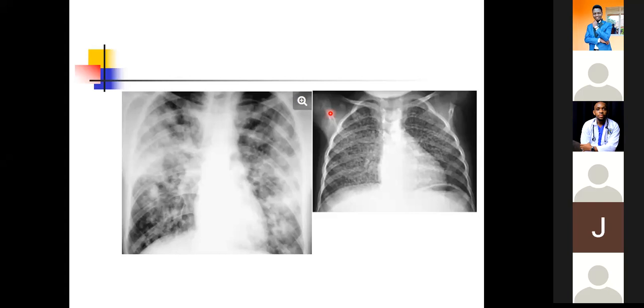Then still in relation to COVID-19, I've seen some CT scans of patients who have the ground glass appearance on CT scan, which is well detailed.